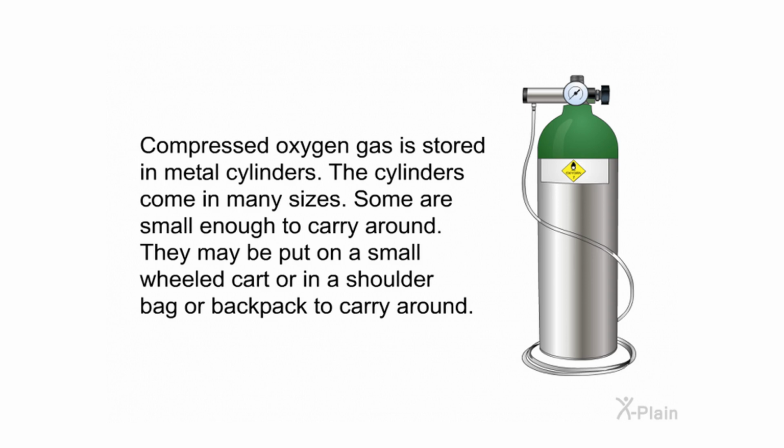Compressed oxygen gas is stored in metal cylinders. The cylinders come in many sizes. Some are small enough to carry around. They may be put on a small wheeled cart or in a shoulder bag or backpack to carry around.